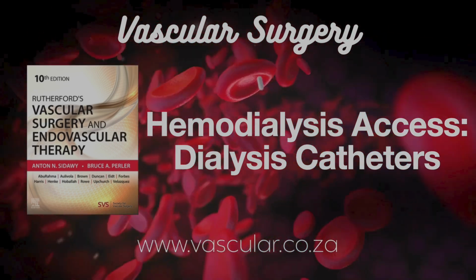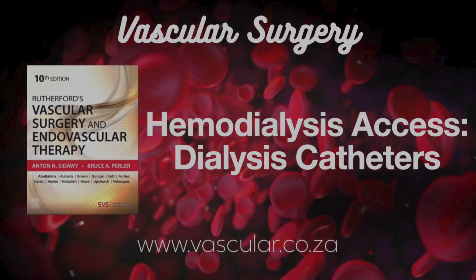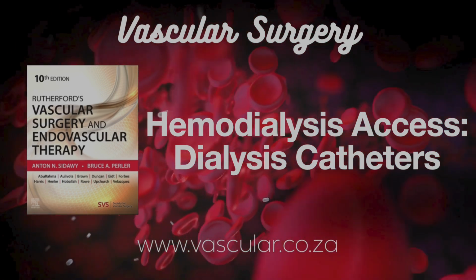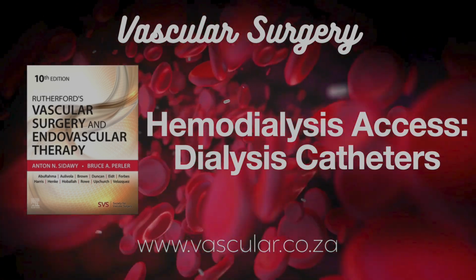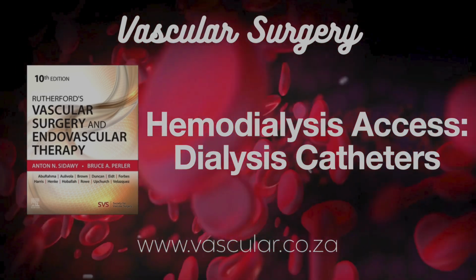So it's not as simple as just pick design X. Not at all. A big review actually looked at all the research and concluded there wasn't really a definitive winner. It points towards the fact that choosing a TDC isn't just about the catheter design itself. It's more about tailoring the choice to the individual patient, their specific veins, their needs. So physician experience and patient anatomy play a big role. A huge role. Which leads us nicely into the next crucial step.